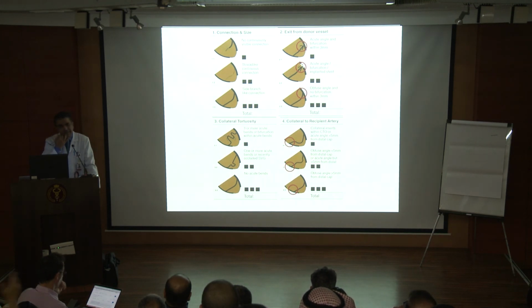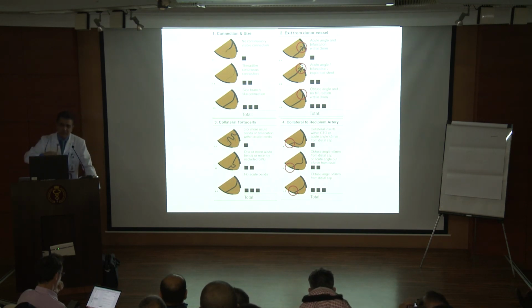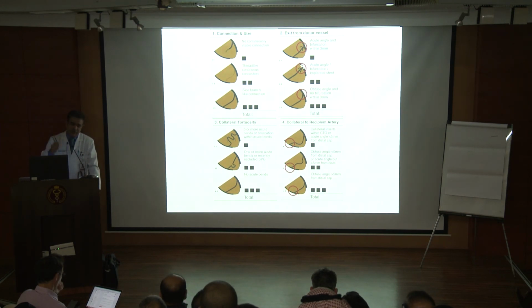The reason behind it is a couple of things. One, the image was done without panning. The second reason is you did not appreciate all these components of the septals: the entry point, the tortuosity, and the exit. So when you do these septals, please pay attention. Take good images to assess and evaluate them. They're very common for the LAD to RCA. If you take an RAO, RAO caudal or RAO cranial, analyze these septals one by one, sit down, and look at it in a detailed fashion.